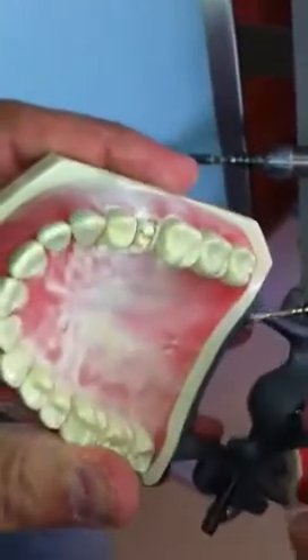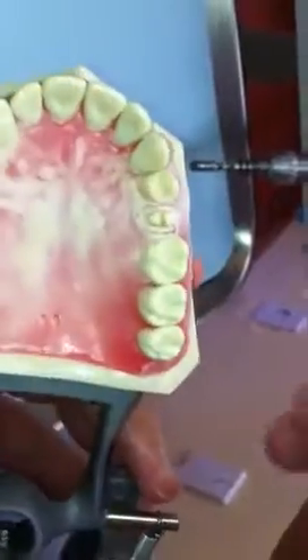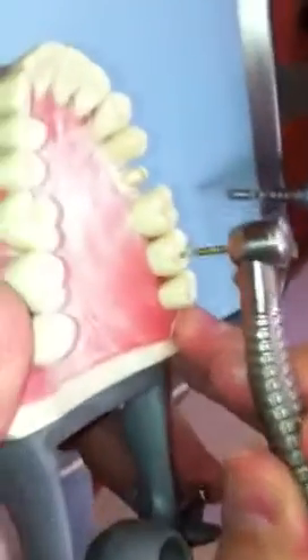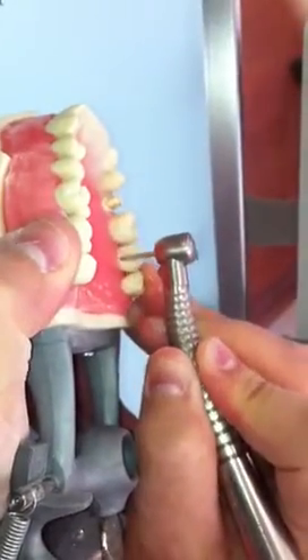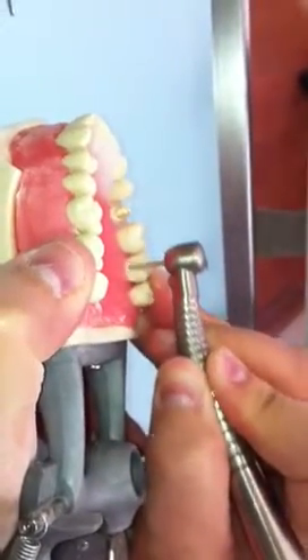Let's do the tooth behind it — two teeth behind it — because I plan on using this as a temporary model. I'm going to start using water because I'm not going to burn my burrs. Water is always a must; it can kill nerves if you don't use it.